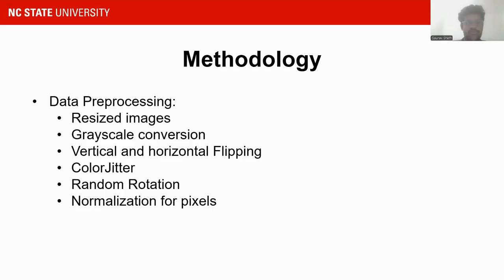Okay, so let's move towards data preprocessing. Our dataset has some class imbalance, like class 0, which is elbow, has around 3,000 samples more than other classes on average. So we perform some data preprocessing. We resize images of other classes which have lower samples, convert to grayscale, vertical and horizontal flipping, common machine learning techniques that we use in data augmentation, and rotations, and obviously followed by normalization.